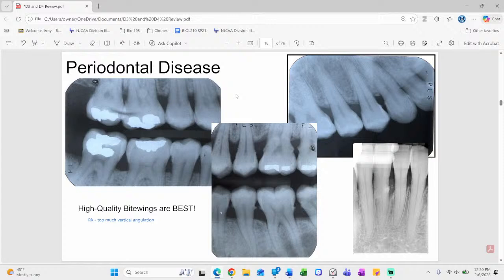Those who have been in radiology, AI has come. Pearl has come. Her name is Pearl, and she's in radiology on those 4 computers that sit back to back. And as we're in there and we've started using it a little bit with a full mouth series, but I want you to do it first. You pick out the caries first. AI identifies, it tries to do bone levels, it does calculus, it does caries. 100%? No way. Right? No way.